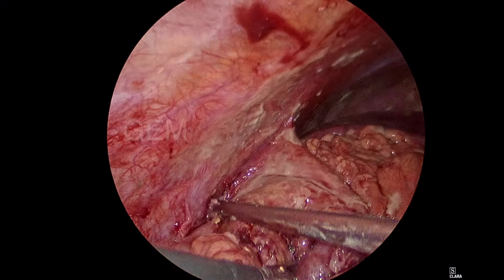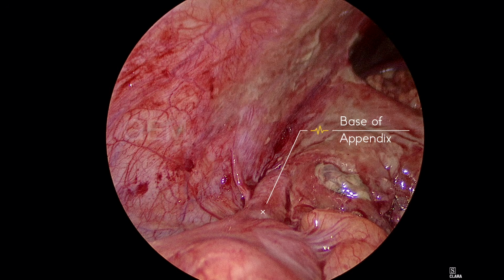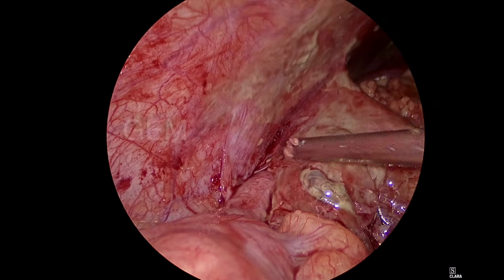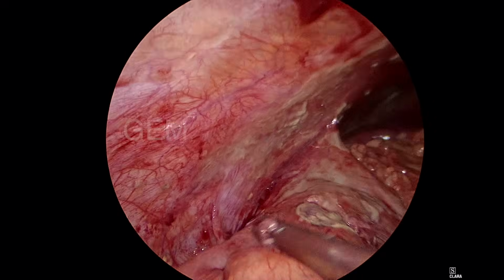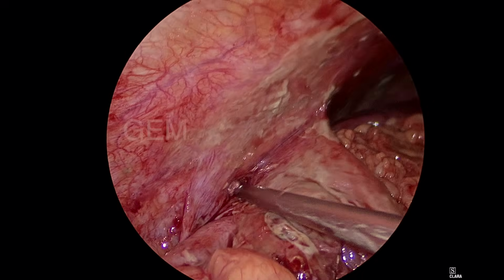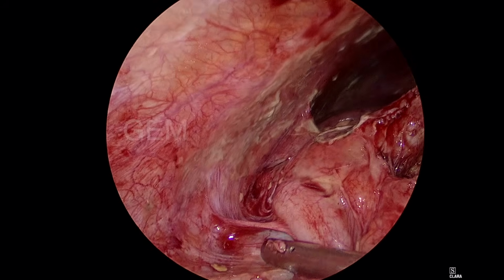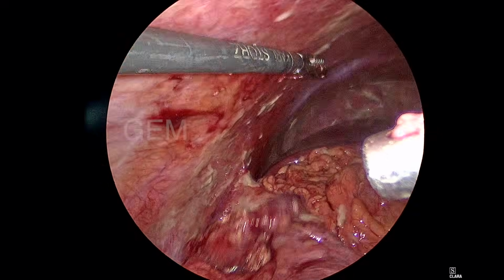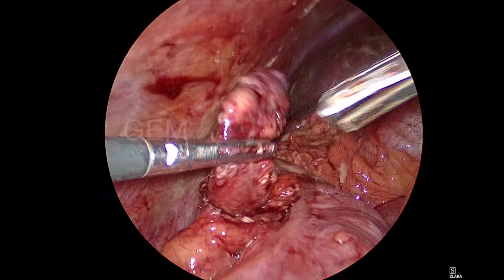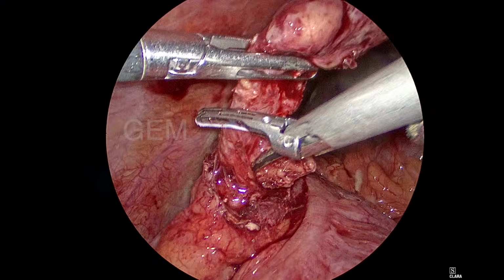And you should not divide the appendix at the level of perforation and then apply the loop, because the base is in a different place, that is the base, so it's curved. So always try to understand the anatomy, then go ahead. Don't rely on the perforation or put the loop there. It looks peritonized and the entire thing is like a mass. So we have to do it very carefully, and always trace the appendix up to the cecum.